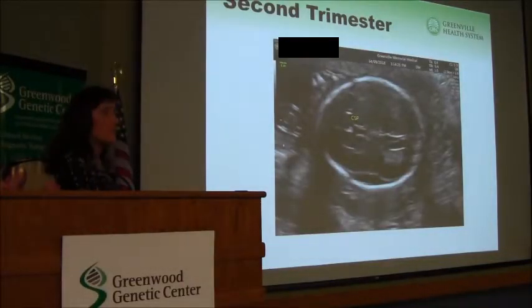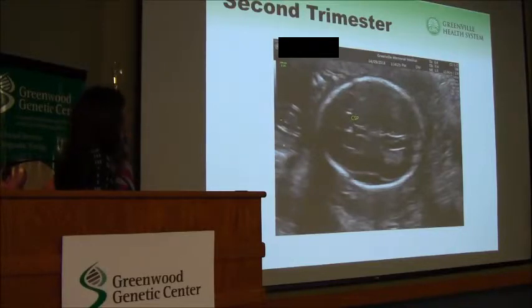All right, shifting to the second trimester. These are normal findings to begin with.